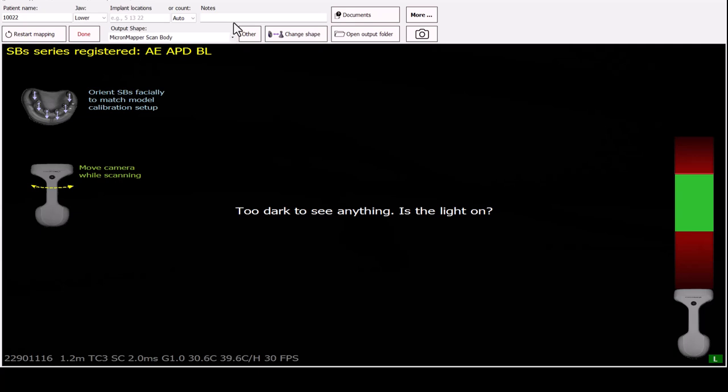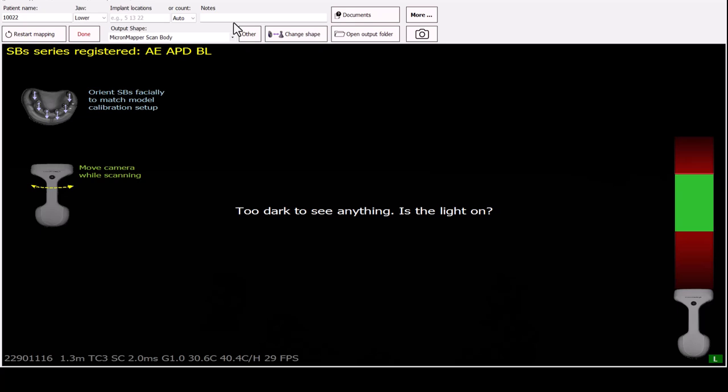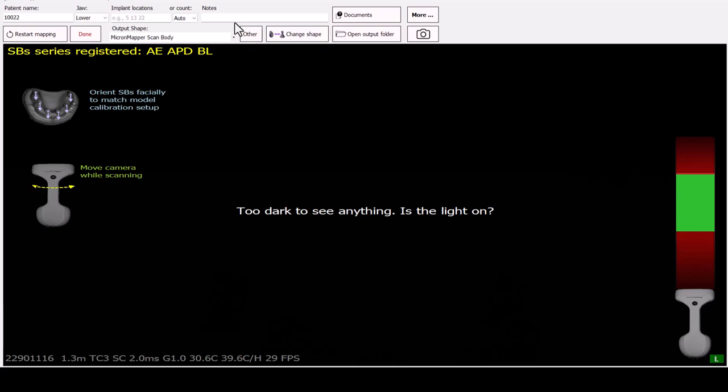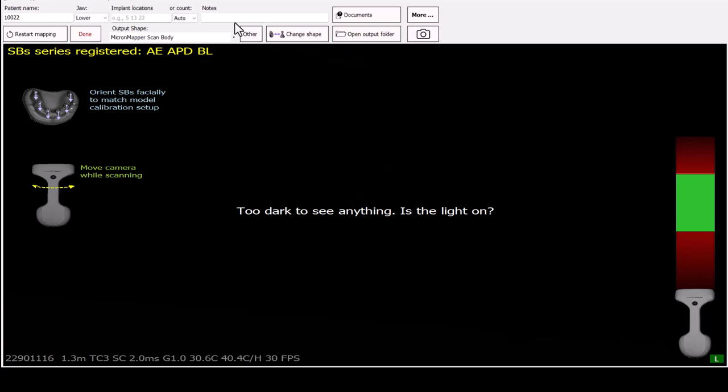Once those steps are complete, you can turn the light on by pressing the black button on your device. Keep in mind that there is an ideal range of scanning displayed to the right. You should aim to be in the green region for the best outcome.